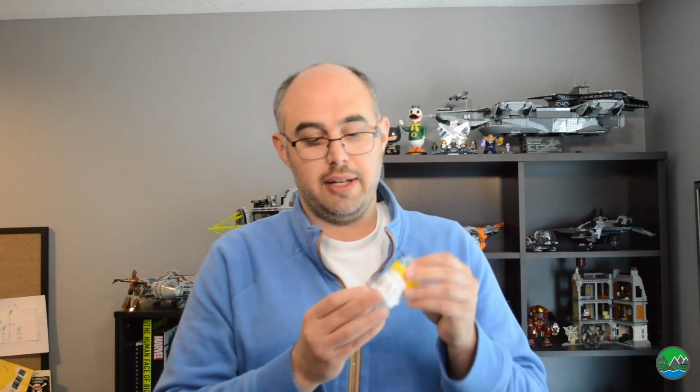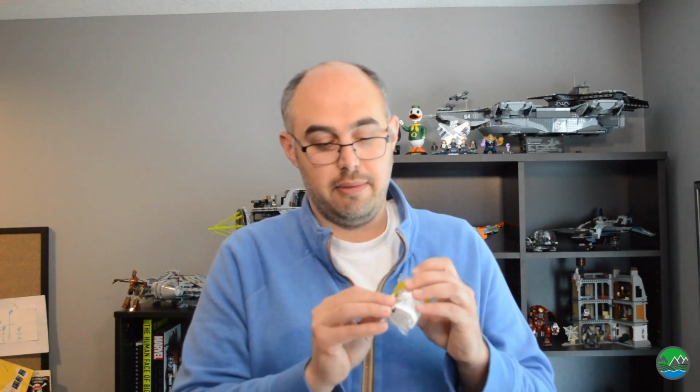So the first thing is this elastic bandage. A lot of people would know this as an Ace bandage, which is more of the brand name, but it's basically a big long piece of elastic fabric that you wrap around, and it's got little metal clips that will hold it in place. This is what you might use if you're trying to stabilize an ankle or a wrist or something like that, or if you run out of tape and you're trying to use your gauze pads, you could wrap this around to hold whatever the bandage is in place. So this is really great to have.